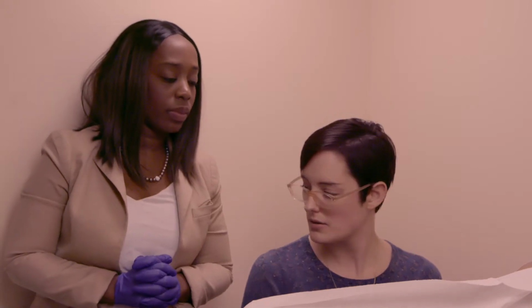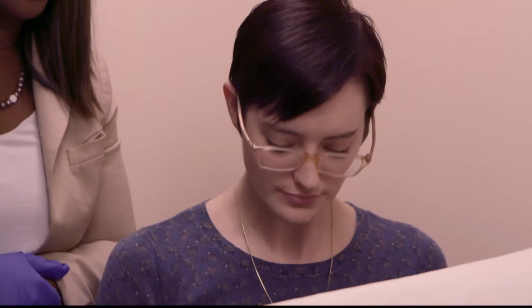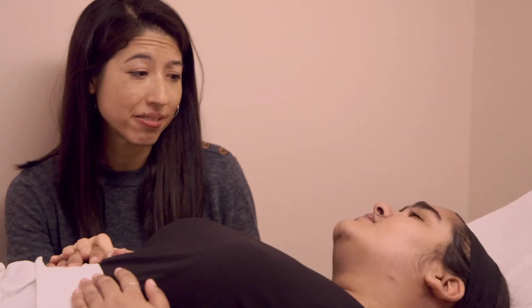You may feel a little bit of pinching or cramping with this. Everybody's a little bit different. How does that feel? It's not too bad. Okay. And now Dr. Roberts is going to give you some medicine to help with the discomfort. You may feel some stinging with this. What are you feeling? It's getting a little uncomfortable, but it's okay. Is this part going to last much longer? This part is almost done.